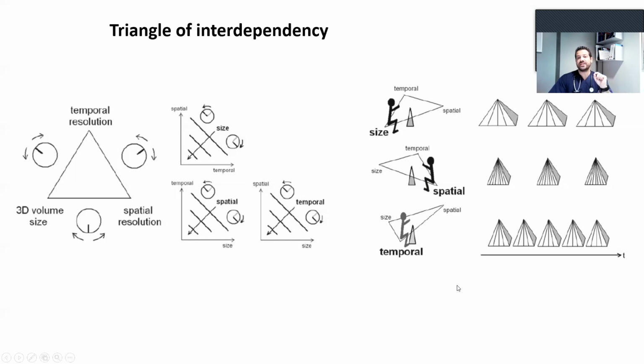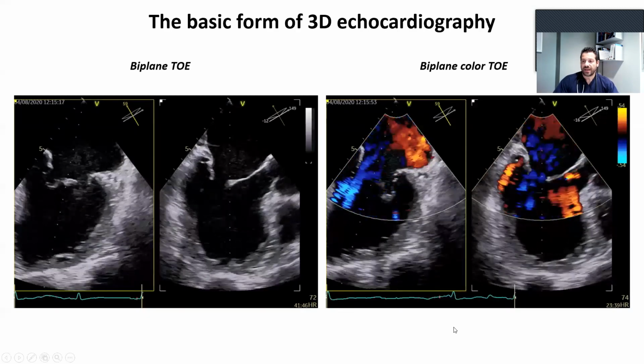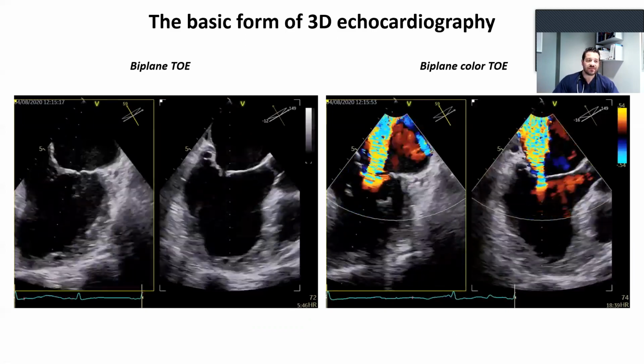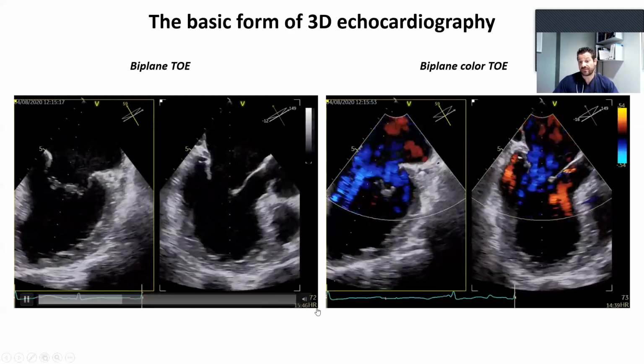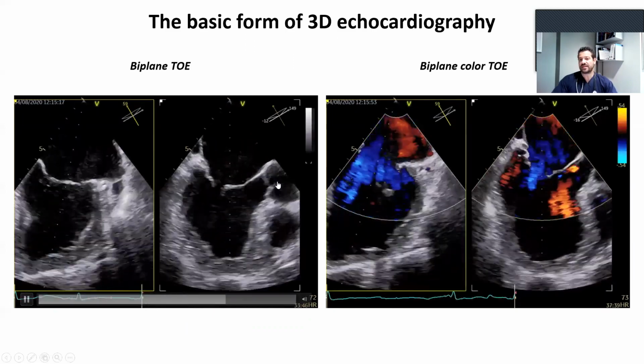So if we reduce the temporal resolution, at the same time we increase the spatial resolution. So there is a direct relationship between these three parameters.